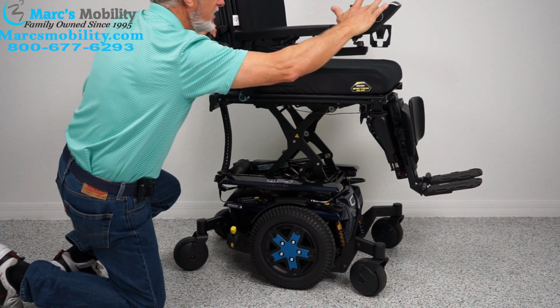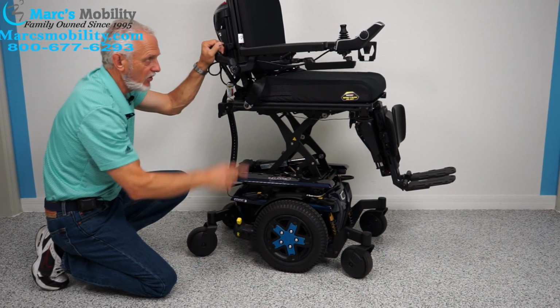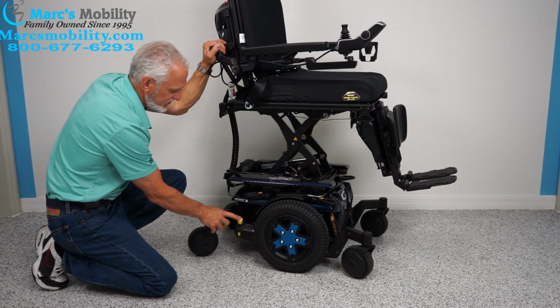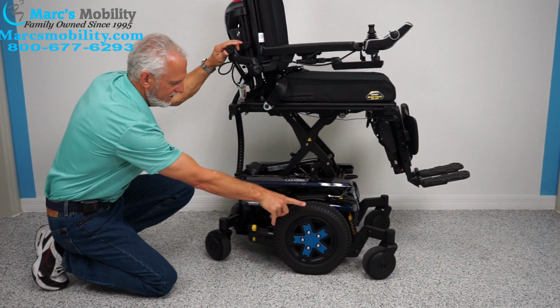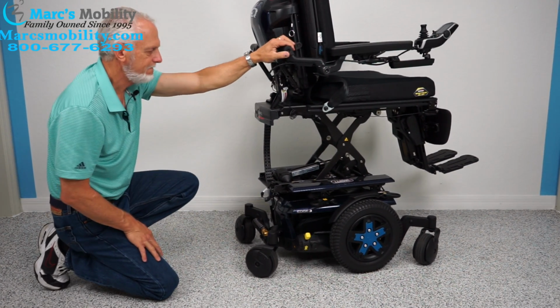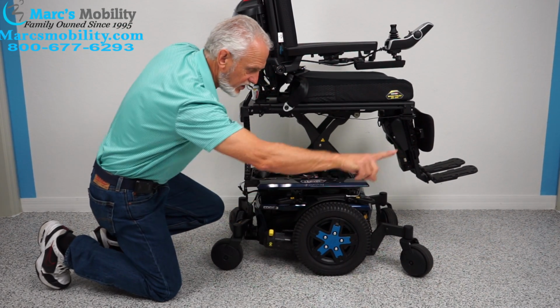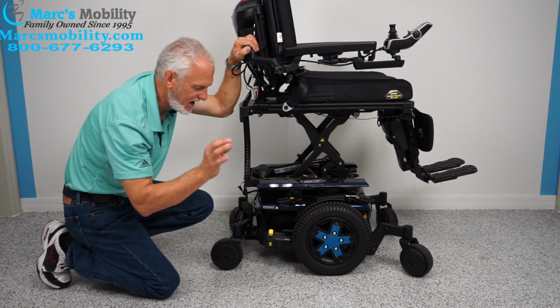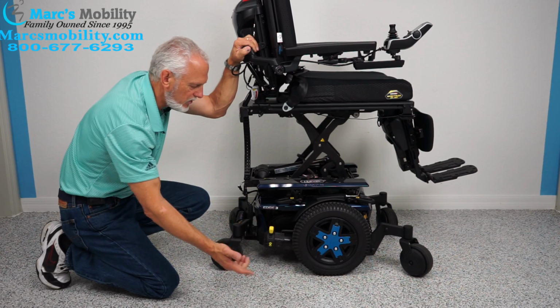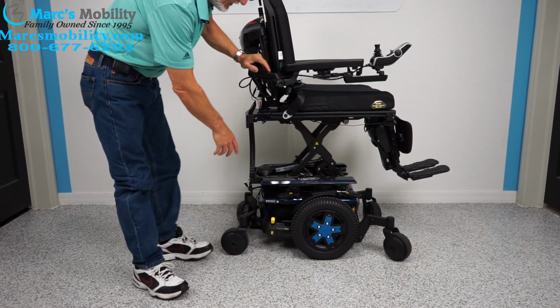But if you turn the power off and you want to roll the chair, okay, turn the power off. You don't want any resistance in the motor. As soon as the power is off, you can push this lever down, and what that does, it unlocks the wheel. You got to do both motors on both sides, okay? Unless you want to go in circles. So when you're done rolling the chair, if you had an issue with the chair, do not forget, put it back in gear, because we have a lot of people forget to do that, and they call the next morning all panicking. So now you got the chair back in gear.